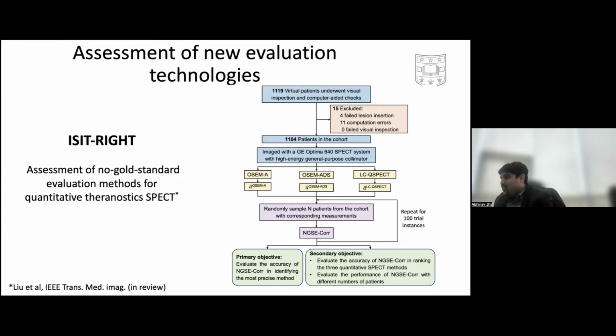Yes, and actually what we found, which I think would be of strong interest to Farishte and several of you as well, was that sometimes you do physician delineations and you think that's your ground truth, but you know that it is inaccurate. What we found was that after a certain level of error, physician-delineation-defined evaluation performance is lower compared to no gold standard evaluation performance. That is the finding Yan presented at SPIE. This also matters as people move towards unsupervised AI, where you have less and less reference truth delineations and reference truth of anything.